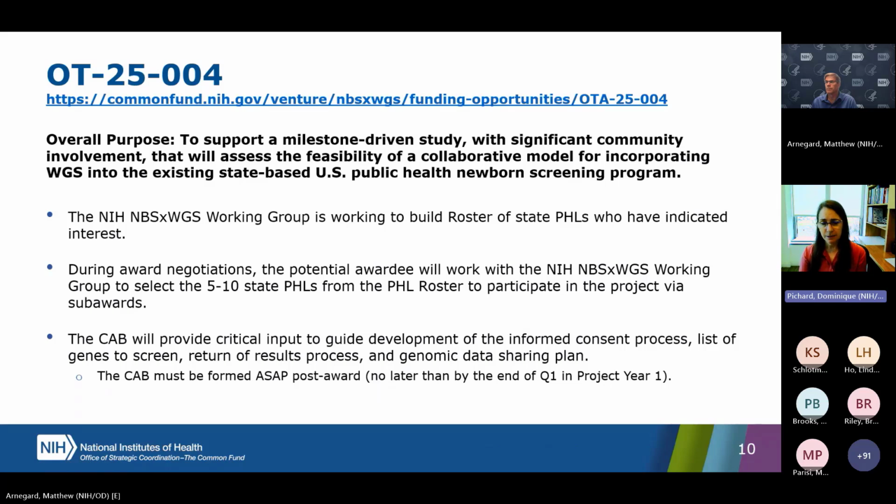The overall purpose is to support a milestone-driven study with significant community involvement that will assess the feasibility of a collaborative model for incorporating whole genome sequencing into the existing state-based U.S. public health newborn screening program.